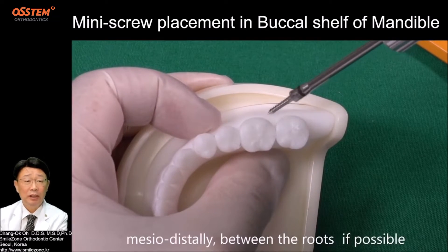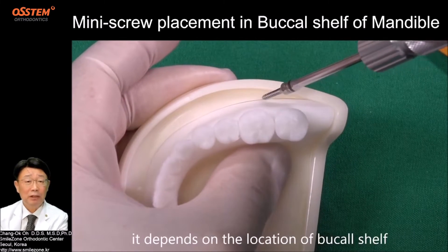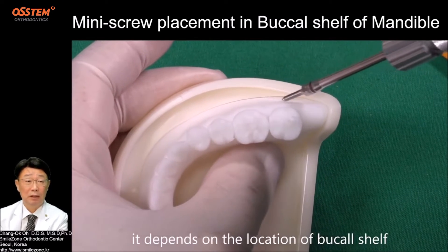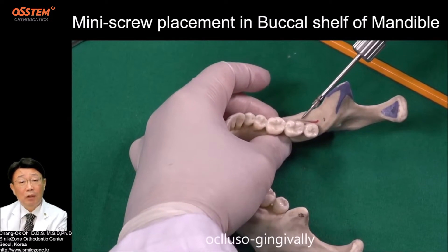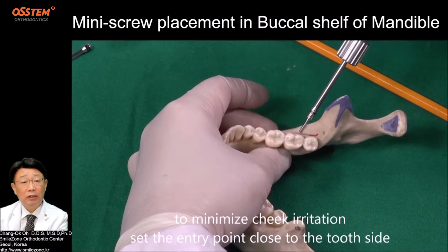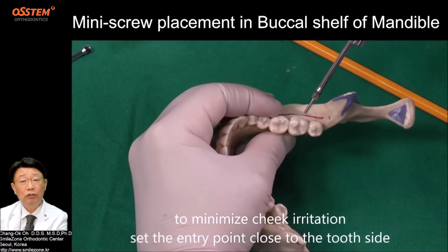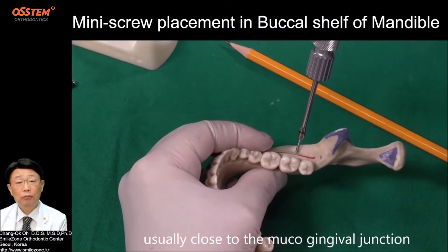Step 2: Determine the point of entry — medio-distally between the roots if possible. It depends on the location of the Buccal Shelf. Step 3: To minimize cheek irritation, set the entry point close to the tooth side, usually close to the mucogingival junction.